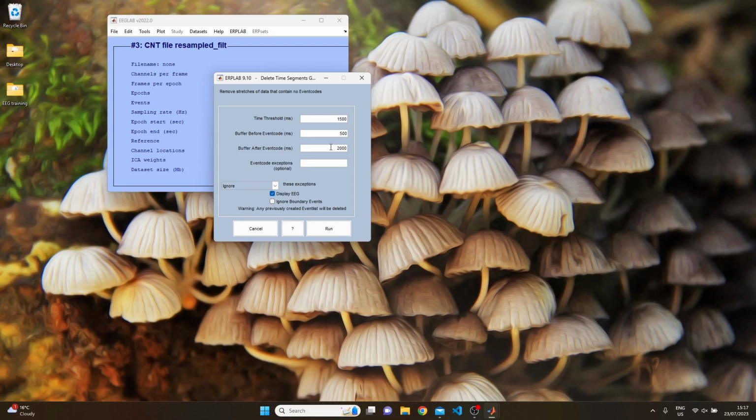Buffer before and buffer after basically lets you dictate how much time you want EEGLAB to leave around triggers when deleting segments of data. Because we usually want a baseline period before our trigger, we might want to set this to about 500 milliseconds. That means that when EEGLAB spots a trigger, it will go back 500 milliseconds before it and only delete up to that point. With my behavioural response as the final trigger in the trial, it doesn't really matter so much what time I set my buffer to, but if my target, for example, was the final trigger, then I would want to leave sufficient time so that I don't cut into the period of interest, so perhaps 1,500 milliseconds.